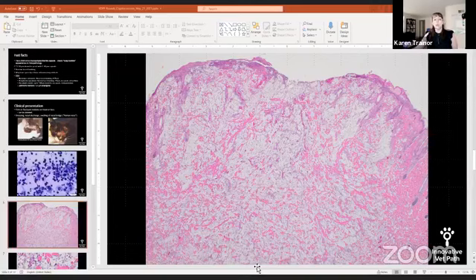And that's this mucopolysaccharide capsule that cryptococcus has, which is something that is unique to this as a pathogenic fungus. Most other types of pathogenic fungi and yeast, in fact, I don't think there are any other, but please let me know if I'm mistaken in this. I don't think any other pathogenic agents have this mucopolysaccharide capsule. So let's go to that. We'll go back to our presentation here.